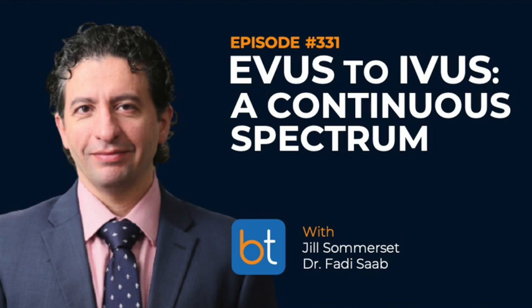So by angiography, you would not... this is my own assessment. I think angiography underestimates the true nature of the disease by anywhere from 50 to 70%. This is my own experience. It's not published data, but that's my own, because I compare myself to myself before we incorporated intravascular ultrasound in our practice, and you notice a big difference. What you saw in angiography that looks pretty normal, you do intravascular ultrasound and you're like, how would I have missed this? I wouldn't have been able to see.